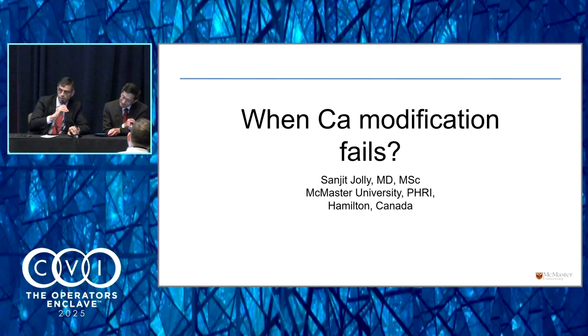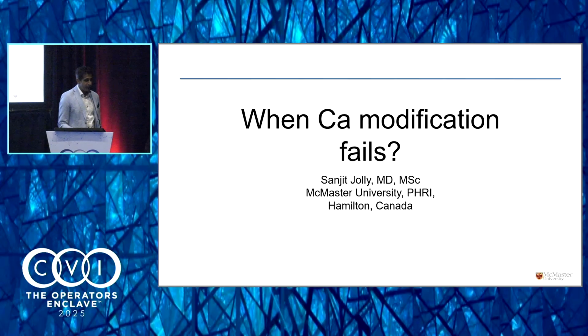One question, you said the perforation question comes up all the time. Apart from undersizing, do you do anything different? Have you had any perforations? And if you have one, how do you treat it? So I think we've all had perforations, and if you haven't had a perforation, you're probably not doing tough enough cases, as someone perhaps has told me. And I have had an OPN NC perforation, and they can be bad.